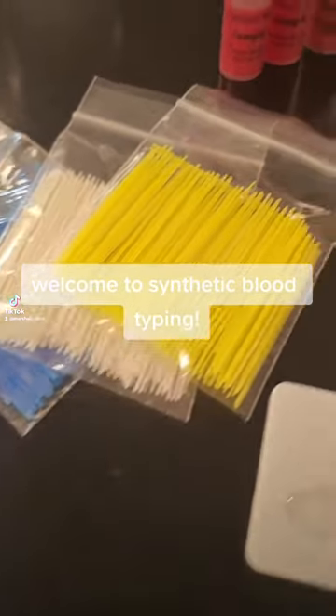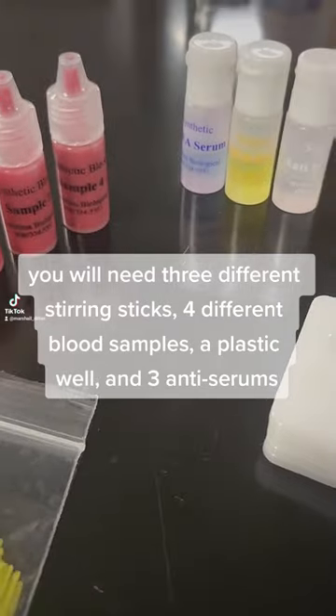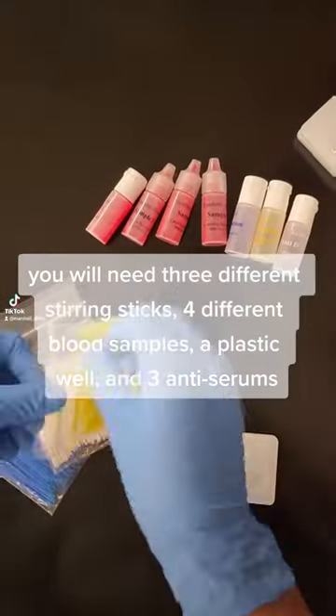Welcome to Synthetic Blood Typing. You will need three different stirring sticks for different blood samples, a plastic well, and three anti-serums.